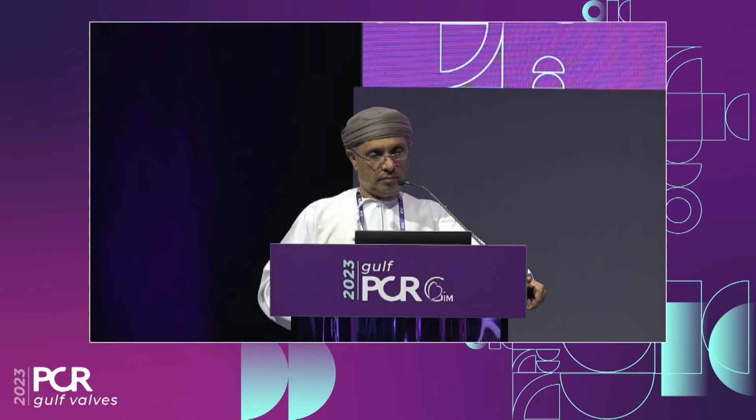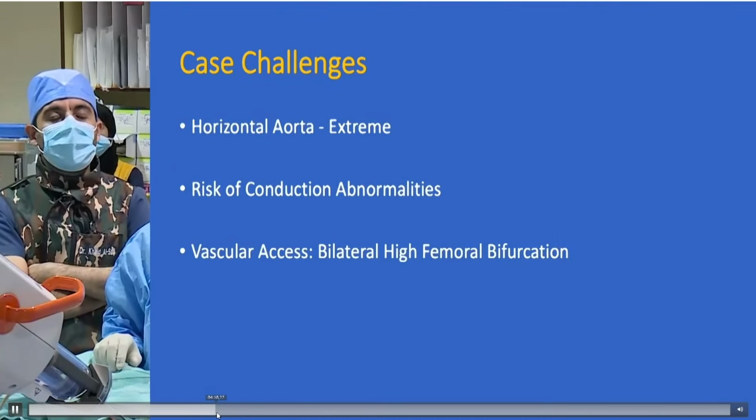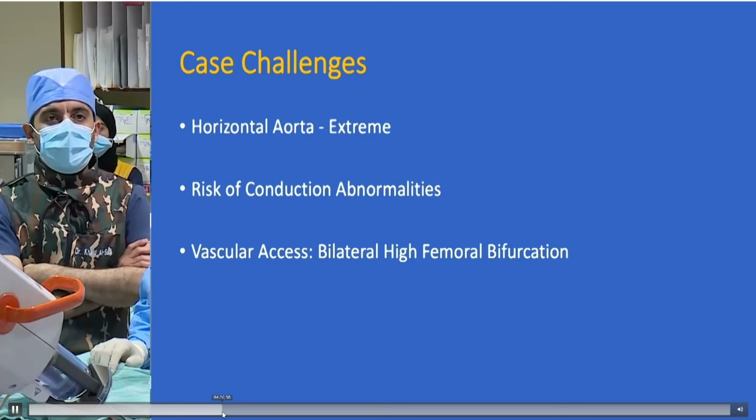You will see. And the other problem in this patient, age and right bundle branch block, for conduction.